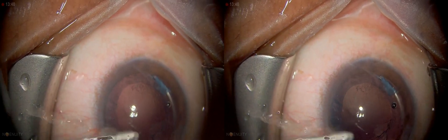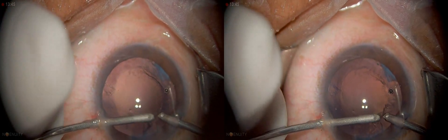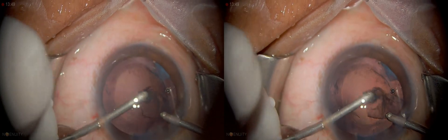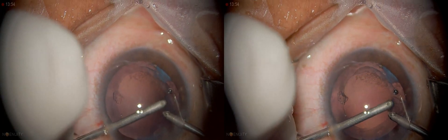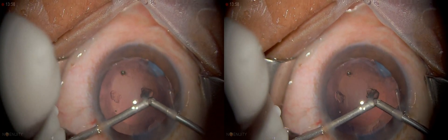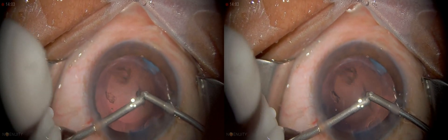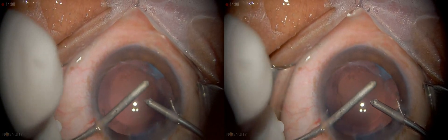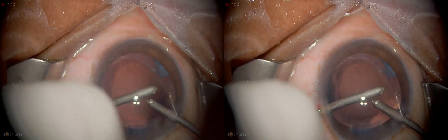I'm going to start doing that last part — removal of the cortex — for which I have switched hands. You have to be very careful: you can see the posterior capsule is bulging up, it has a convex upward shape. Very, very important — you have to be extremely careful when polishing it, because the vitreous pressure is a little bit on the high side.